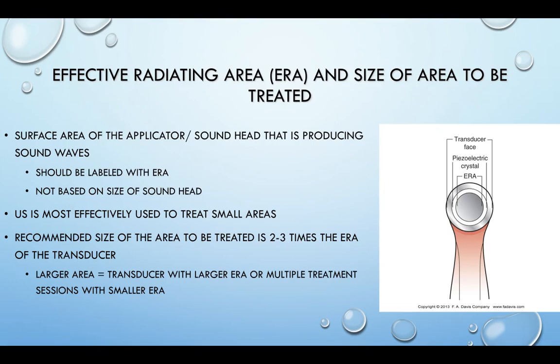You should not just increase the time, okay? Because of the way we move the sound head, we don't want to move the sound head all the way up into that 20 centimeter area, because again, that will allow the energy to disperse before you get back to the one part of the tissue. And so it's better just to do 2 separate treatments to target that area. Or we potentially use a different modality. We'll talk about diathermy as a way to heat deeply larger tissue, larger areas than ultrasound can.